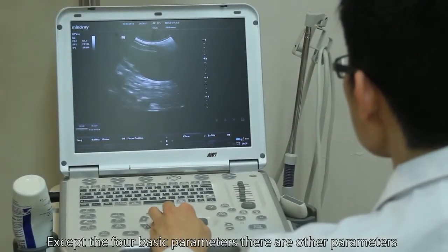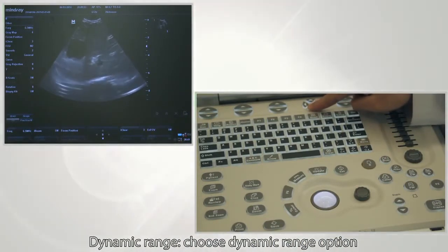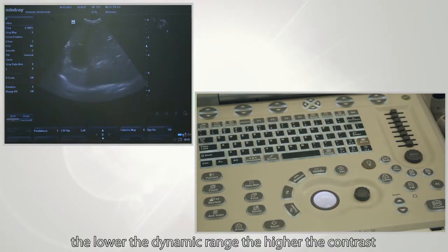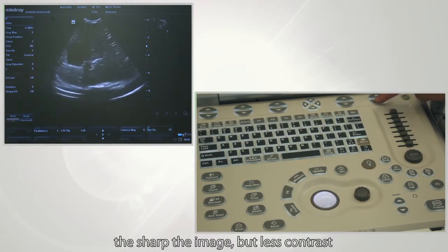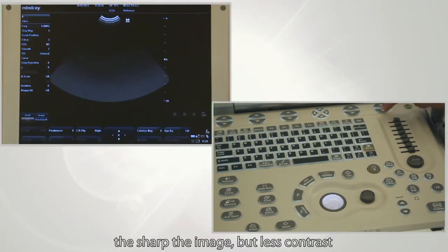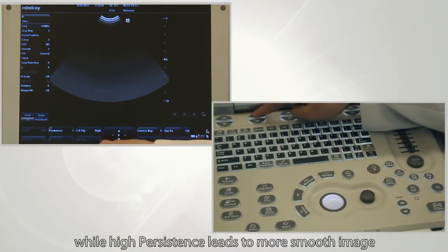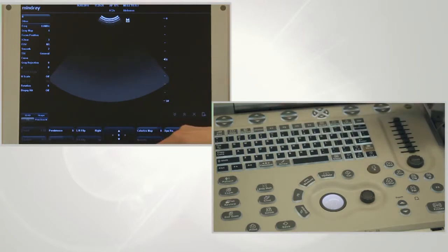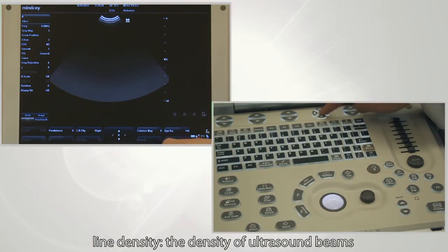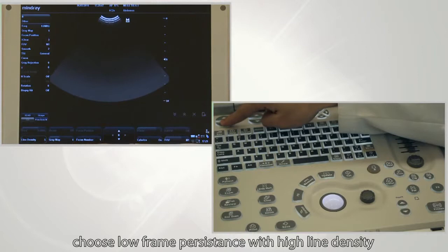Other than the four basic parameters, there are also other parameters that can affect image quality significantly. Dynamic range: the lower the dynamic range, the higher the contrast but the less smooth the image; the higher the dynamic range, the sharper the image but less contrast. For persistence, low persistence corresponds to high contrast, while high persistence leads to a smoother image. Line density refers to the density of ultrasound beams. When performing cardiac scanning or when the animal has serious asthma disease, choose low frame persistence with high line density.